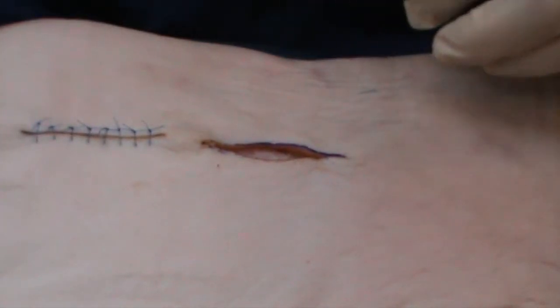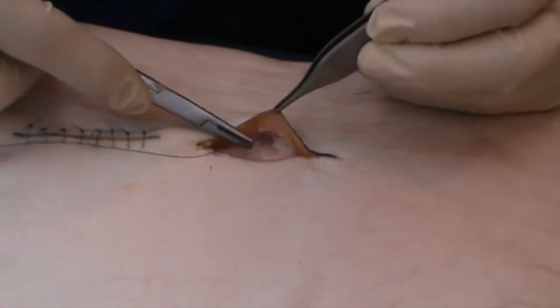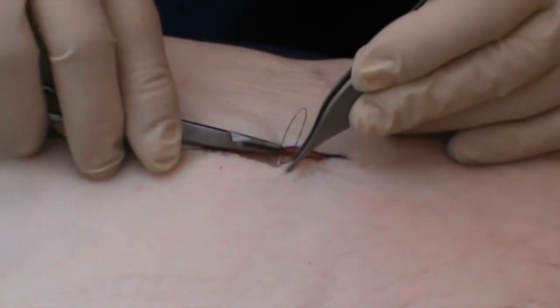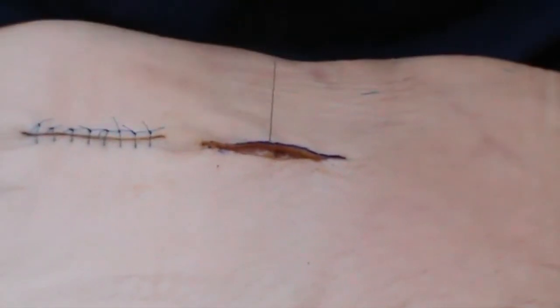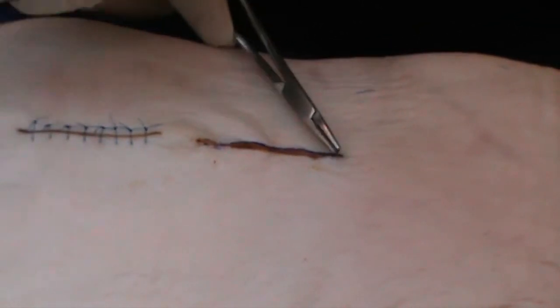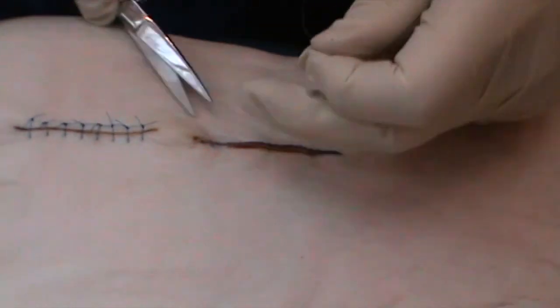And if I put in maybe another one or two of these, you'll look at this surface and think it requires very little now to keep the wound edges together. Maybe just two or three skin stitches. Deep to superficial, superficial to deep. Rotate it out. And if I just leave it at these two, you can see that in order to close this wound will require very little.